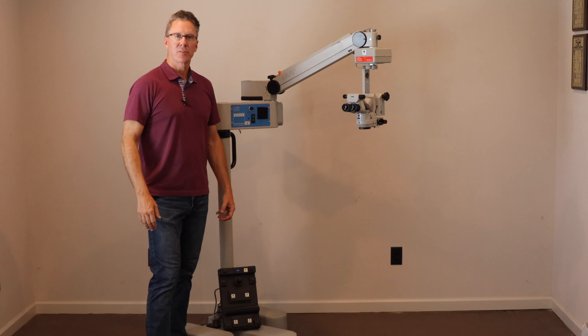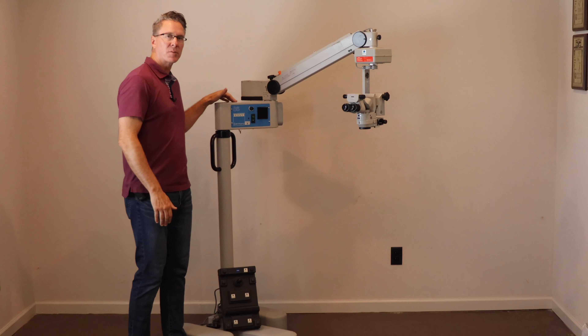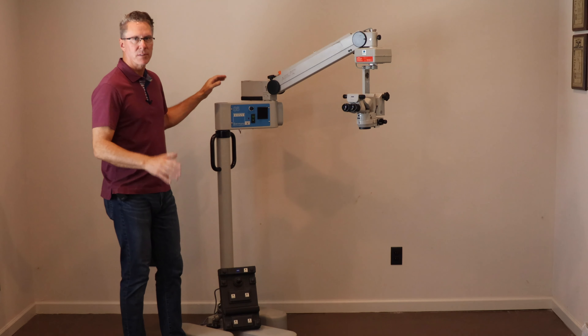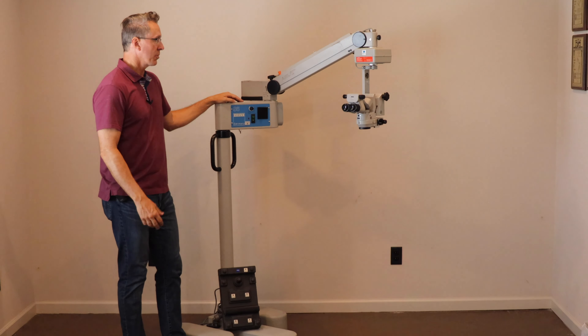Hello, I'm Rob Hewlett with Surge Instruments, here to talk with you about the Zeiss MDU on S5 floor stand that we have in our inventory. Zeiss sold thousands of these microscopes for ophthalmology. It is a terrific system for ophthalmology.